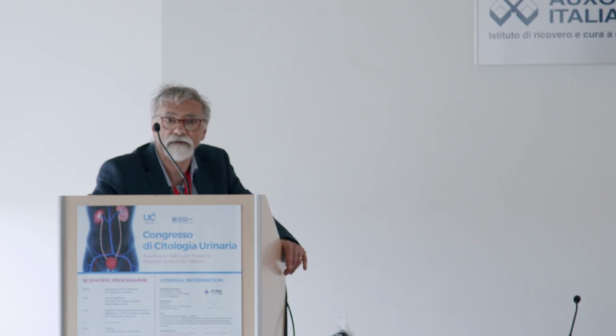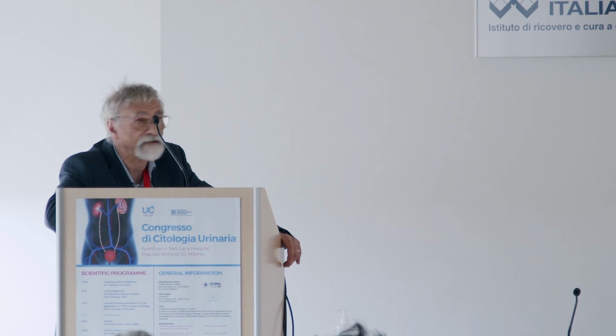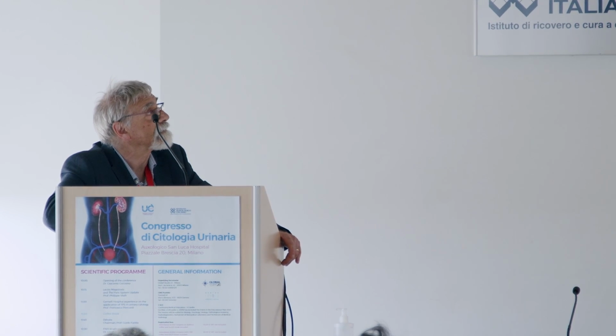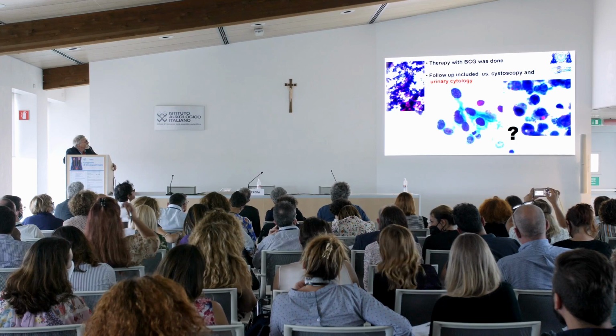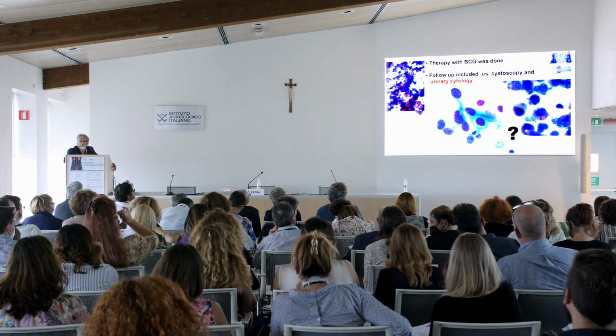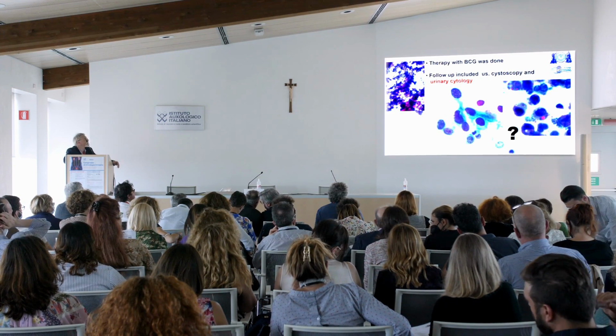Lately, the urologist performed BCG therapy, with ultrasound and cystoscopy in the follow-up. But there was one cytology during the follow-up. Your opinion?